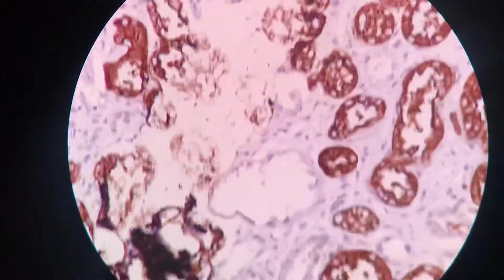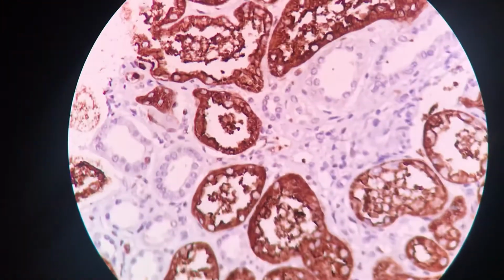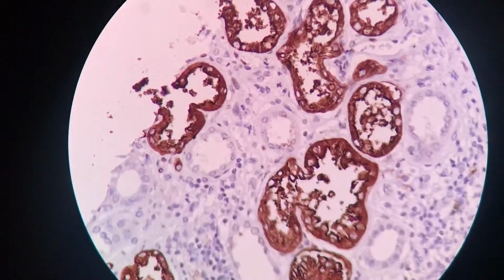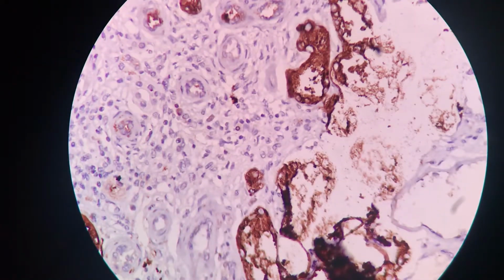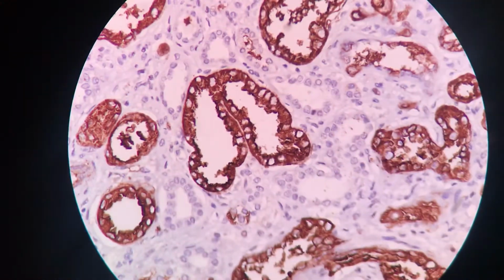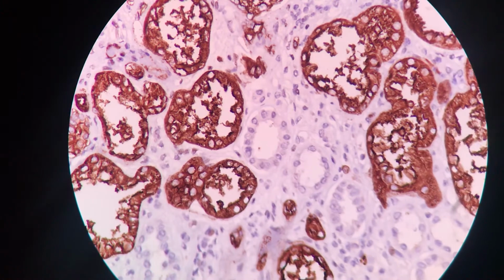In some part, there is serration, which has resulted in such frayed staining. That is not the fault of staining, it is the fault of sectioning, so that may be ignored. And you can see there is hardly any background staining, and there is no evidence of any non-specific staining as well. So this forms a good staining of the renal tissue.